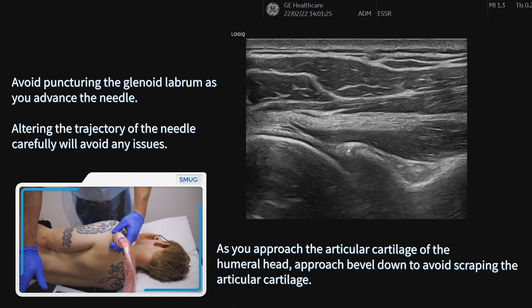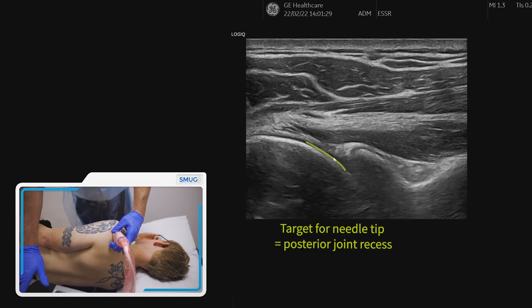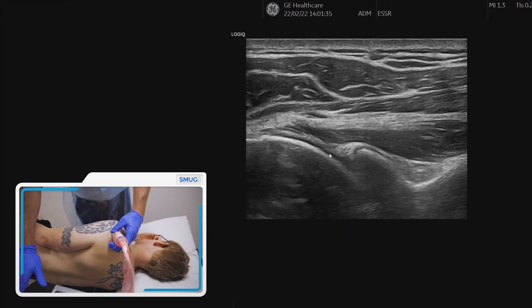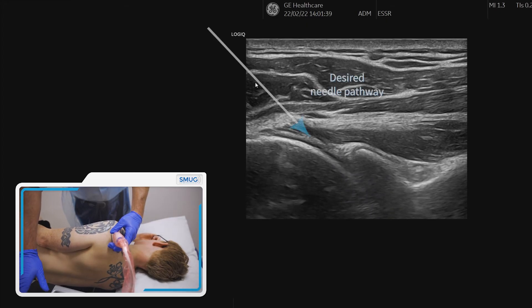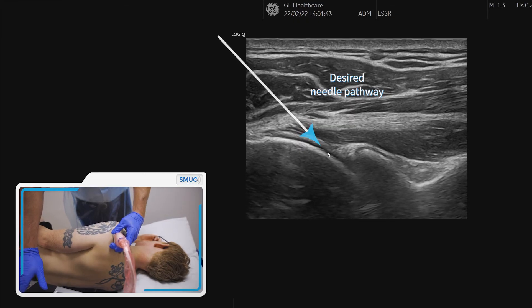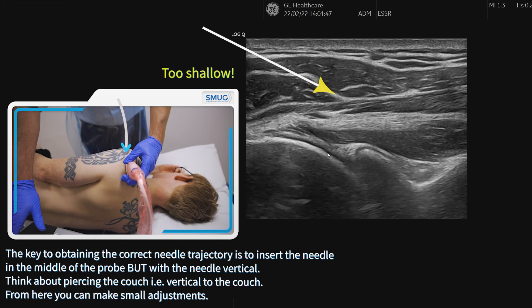You can see the labrum sitting on top of the glenoid, and the target area is here. This is the posterior joint recess, and this is where we're going to be targeting our needle placement — coming from the top-left region all the way down into the posterior joint recess.